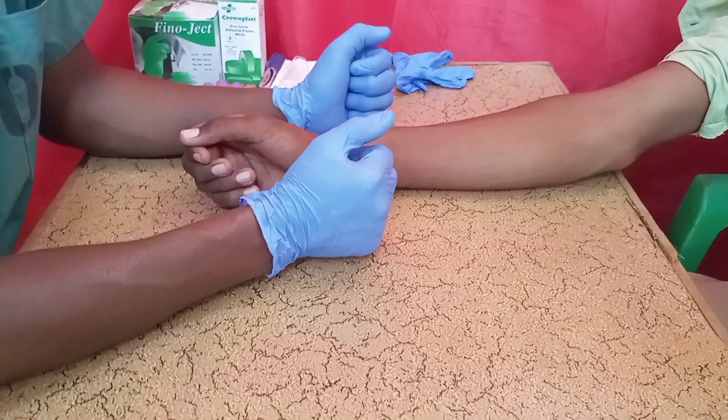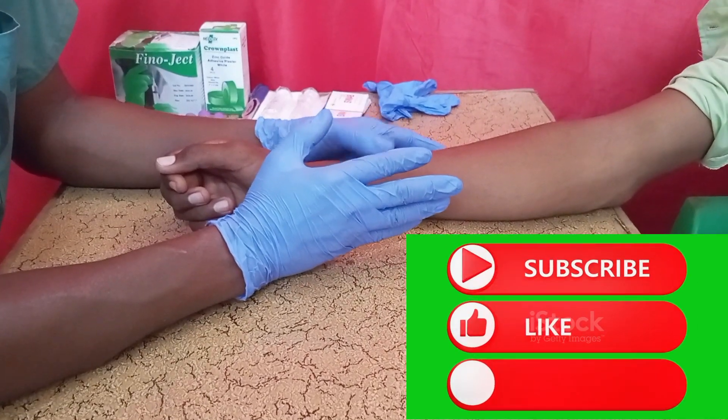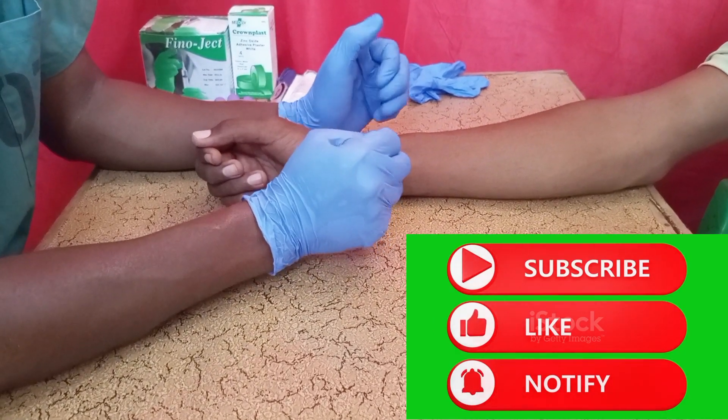Hi everyone, welcome back. In today's video, I am going to show you how to take blood correctly — the order of blood draw by using the syringe. Before you start the procedure, here is what you are supposed to do.